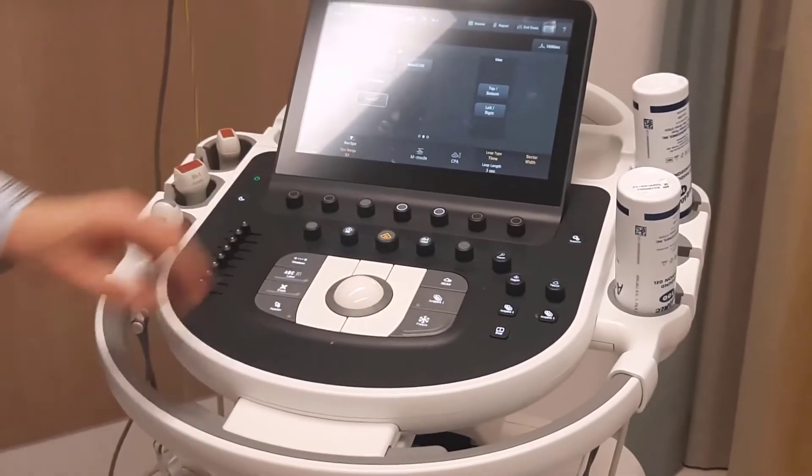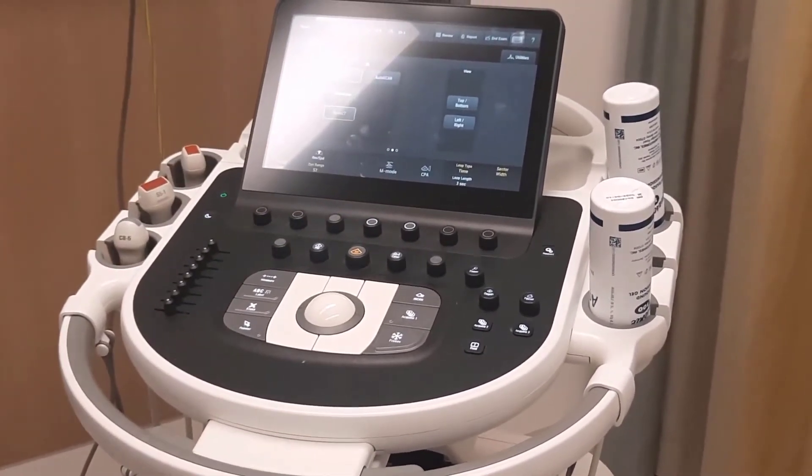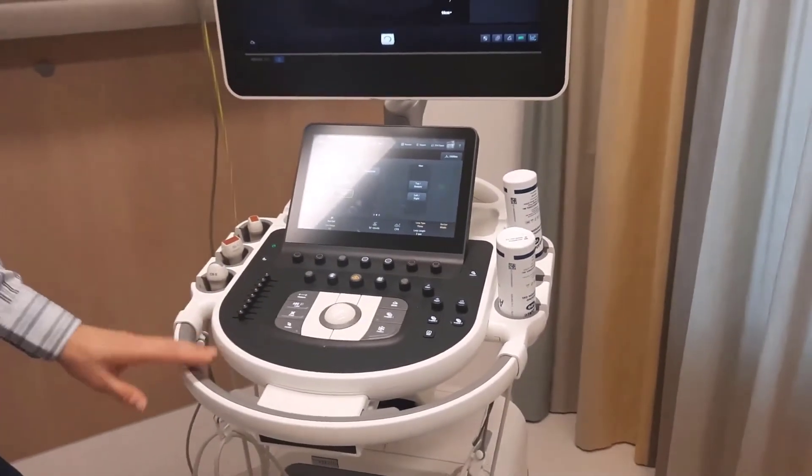Every year, we take a picture of the transducer without any gel, to confirm it's the same as the year before.